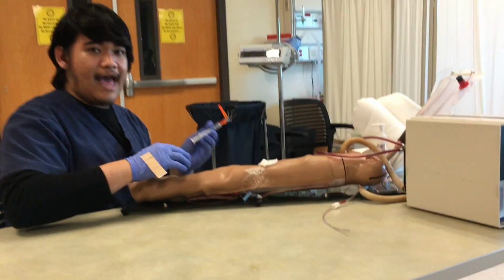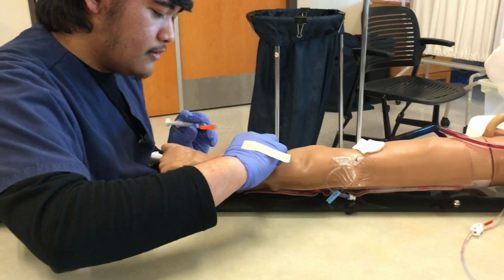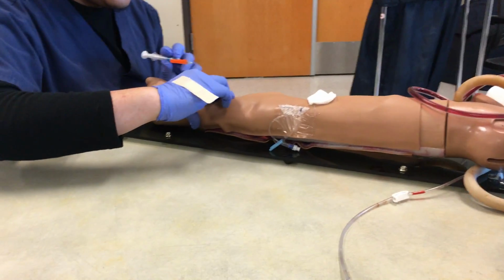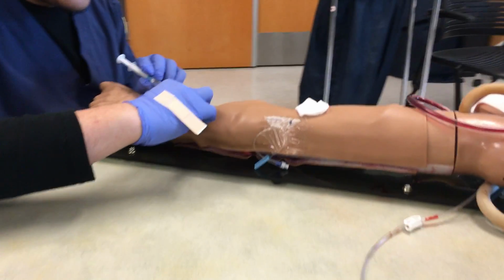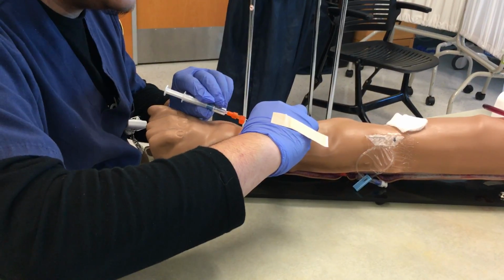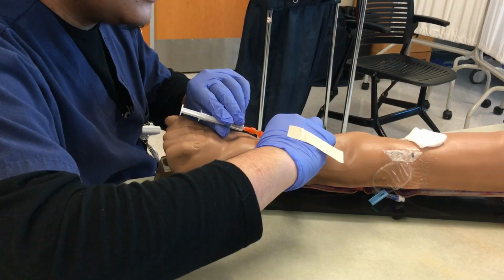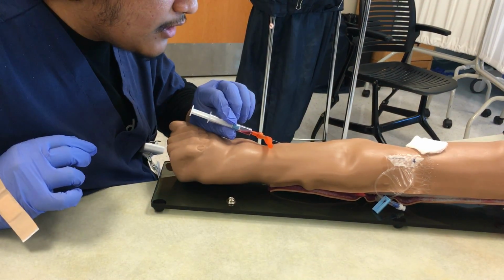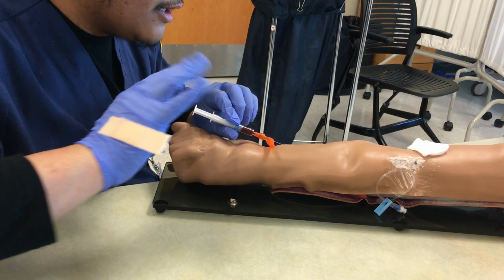I'm going to uncap it. Feel again. Make sure you can see the bevel. Once you feel it, you could advance the bevel. Feel it again, make sure that you're in the right place. If not, you could reposition. Once you know that you're in the right place, you could advance. So you could see that there's a blood return. If it's fast like that, you know that it's an arterial.